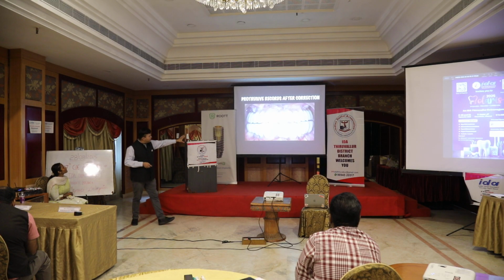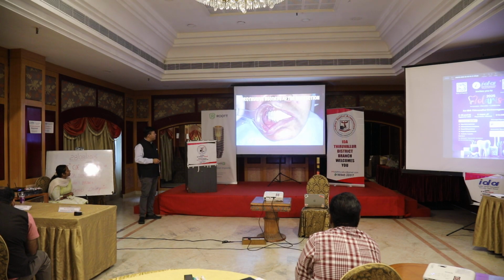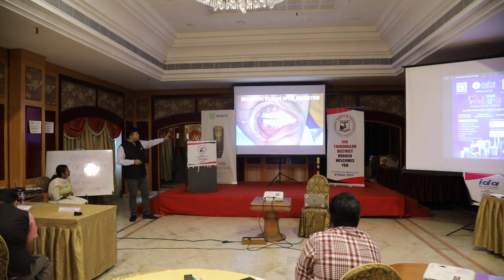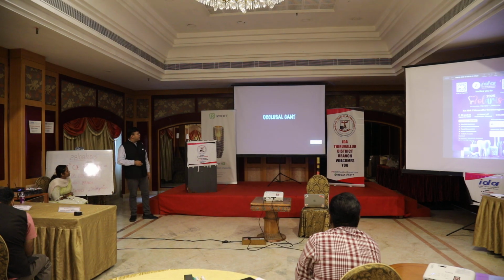Do you see here that now the protrusive looks to be better? If not good, it is at least better than what it was. This is after correction. Now when I ask the patient to give me a protrusive, you can see that there is no posterior in contact.